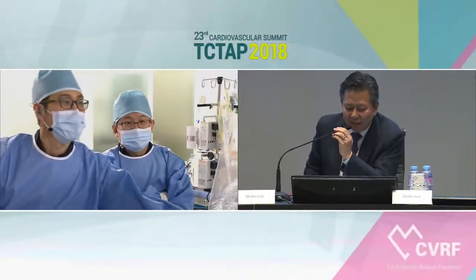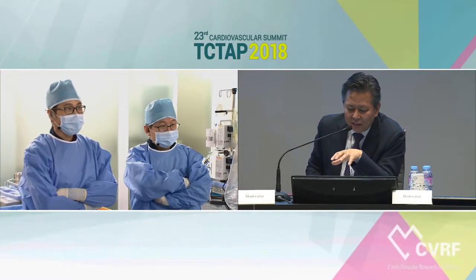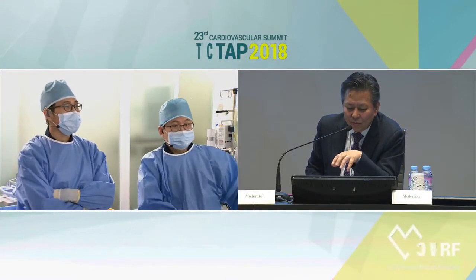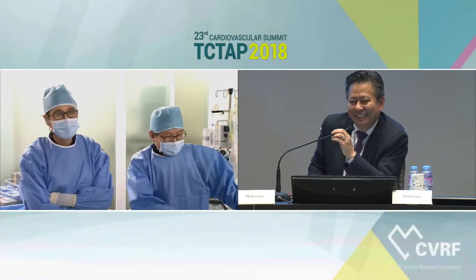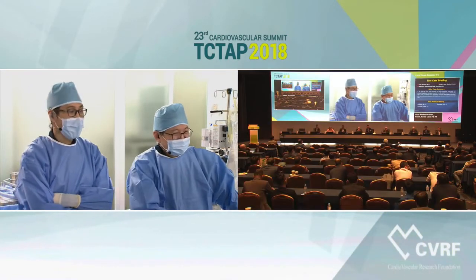Hello. Dr. Han, would you like to explain the final result? Maybe you open the side branch instead of SJ Park. Yeah. Okay, long please.